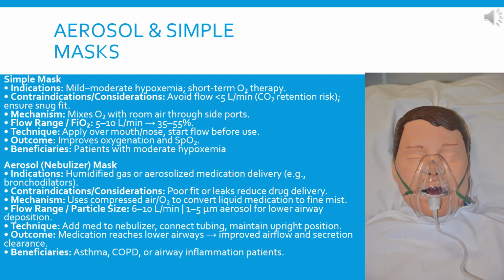Indications, humidified gas or aerosolized medication delivery. Contraindications or considerations, poor fit or leaks reduce drug delivery. The mechanism uses compressed air or O2 to convert liquid medications to fine mist. Flow range, particle size, 6 to 10 liters per minute, 1 to 5 micrometers aerosol for lower airway deposition.